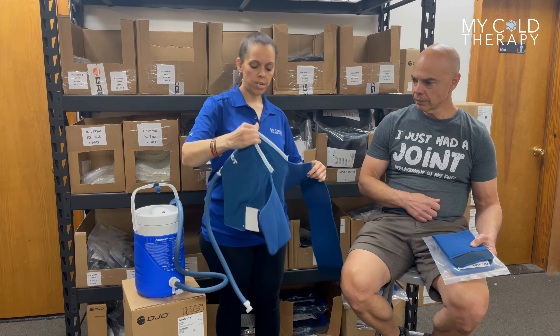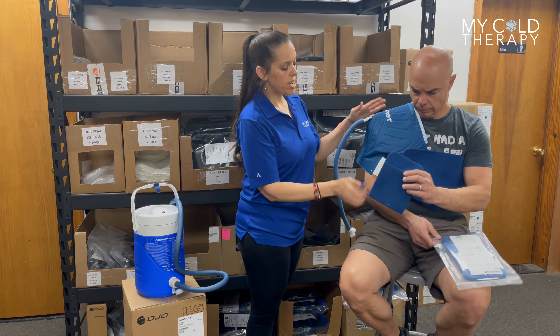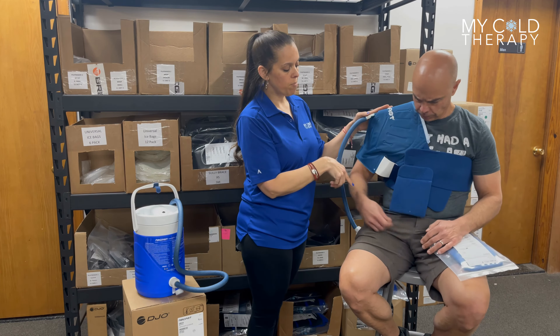Now with these pads, they also have an additional sling. You may need this, you may not, but if you do, it attaches right here at the bottom and then you stick your arm through it. At this point, you're ready to take your hose and connect to your system to do your therapy.